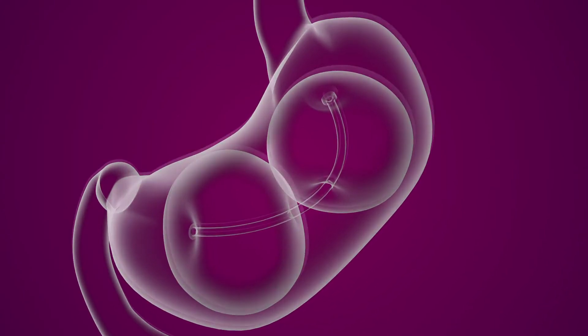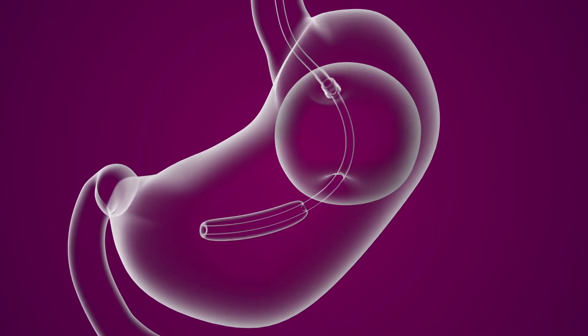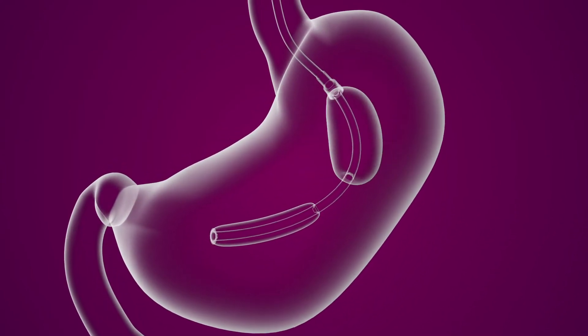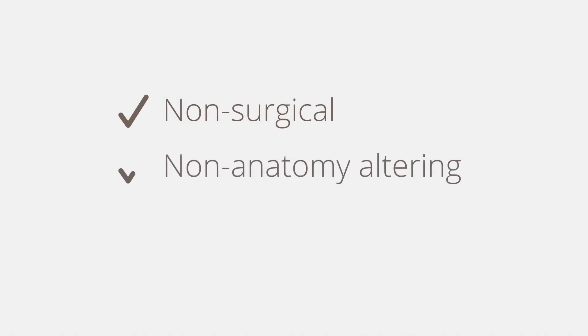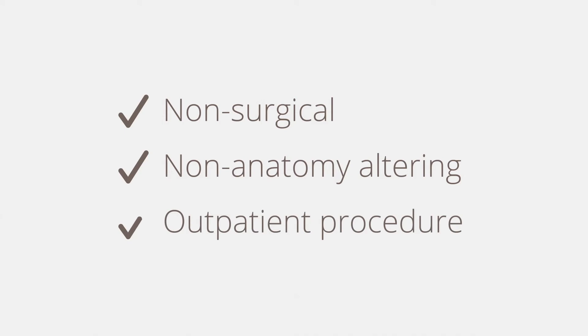The balloons remain in the stomach for six months. After six months, the balloons are deflated and removed during a similar endoscopic procedure. Both the insertion and removal procedures are non-surgical, require no incisions or permanent changes to the digestive system, and may be completed in an outpatient environment.